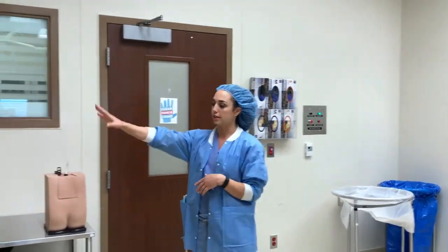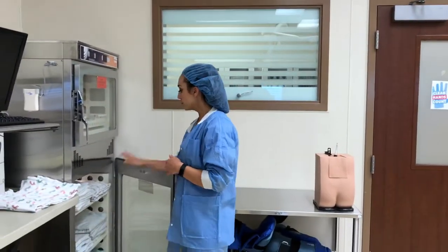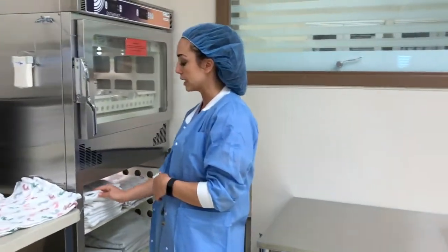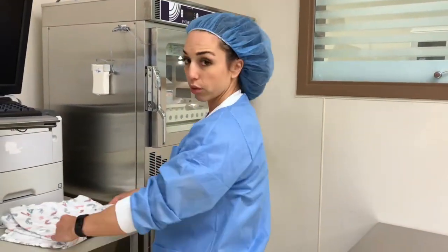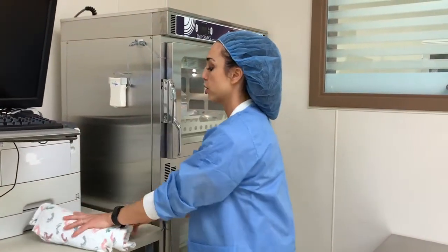On your right, you're going to see this warmer, and this is where they keep the warm blankets down here, and then the warm fluids up here. As soon as I enter the room, I usually grab towels, some people like using towels, some people use the baby blanket. Personally, I grab two baby blankets out from the warmer, and then you create a roll. You guys will see this a little bit later. This is going to be our baby bump, so we'll show you that in a minute.